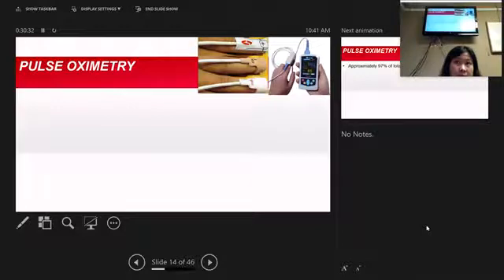Okay, so even if you just say, wash my hands again, before you pick up that pen, just say, wash my hands, and then you're going to record on their chart. Just put your result. And counting for 1 full minute for pulse, or counting for 1 full minute for your respiration. Okay. But on the written part of the test, it says if you have a regular pulse or regular respirations, some places will let you count for 30 seconds and multiply by 2.